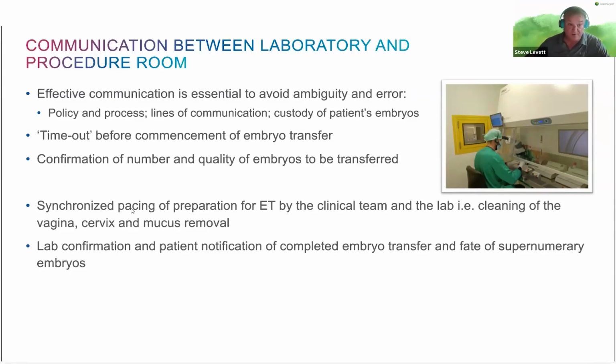But we're going to synchronize the whole process by how they're going to prepare the patient, whether when they clean the cervix, remove mucus, etc. We don't want a big gap once they're ready to getting the embryo loaded and brought through. So these things are important. Communication between the different functions within the clinic, not just in embryo transfer, but in all aspects, is extremely important.